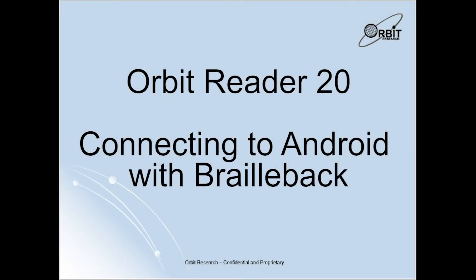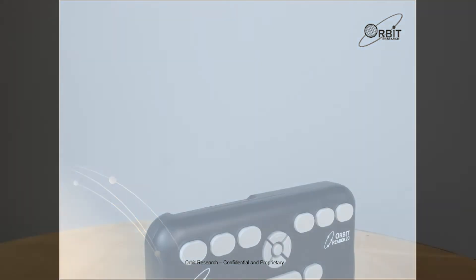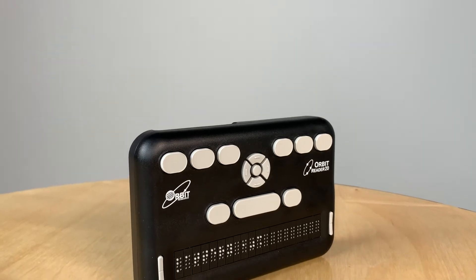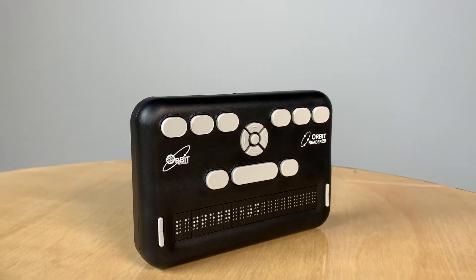Hello, and welcome to the Orbit Reader 20 Connecting to an Android with BrailleBack video. Today, I will show you how to connect your Orbit Reader 20 device to your Android cell phone via Bluetooth in the BrailleBack app.